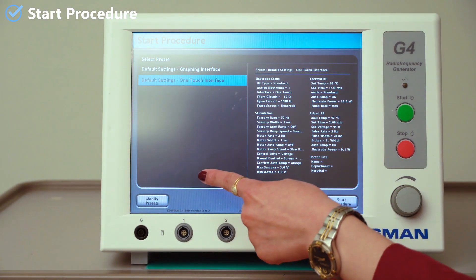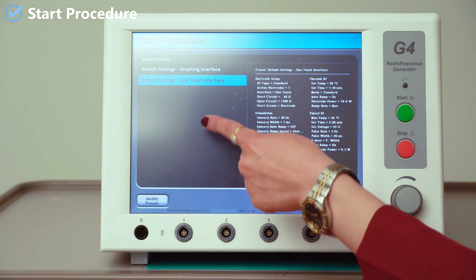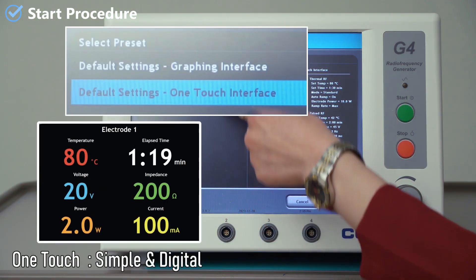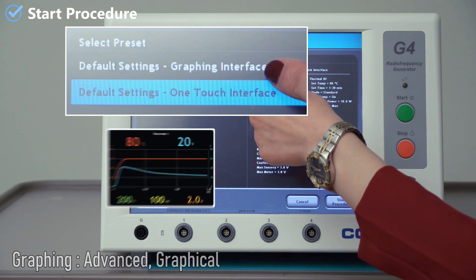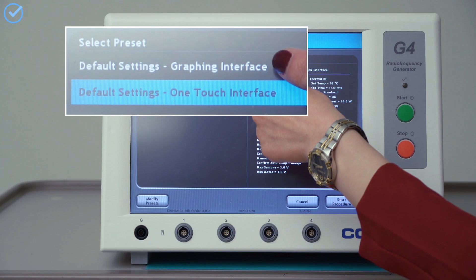To start a procedure, the generator has two screen interfaces: the one touch, which is simple and digital, and the graphing, which is advanced and graphical. This features a large, color-coded reading.